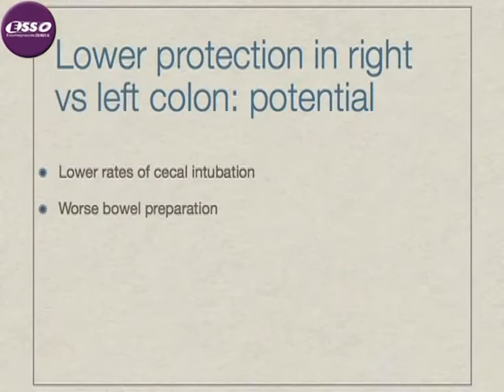Second, bowel preparation tends to be worse on the right side of the colon than the left side. This discrepancy in bowel preparation can be overcome by using either split dosing or same-day dosing of bowel preparations. Split dosing refers to giving half the preparation the evening before colonoscopy and the other half on the morning of colonoscopy. Split dosing counters the tendency of the right colon to have adherent mucus and small intestinal secretions when the interval between completing the preparation and performing the colonoscopy is too long.